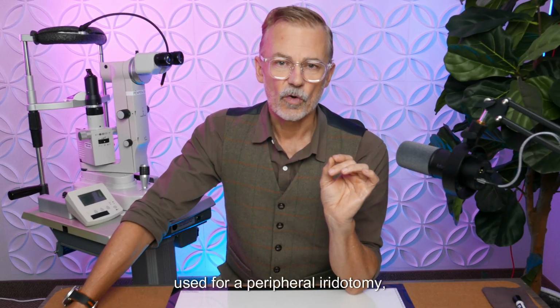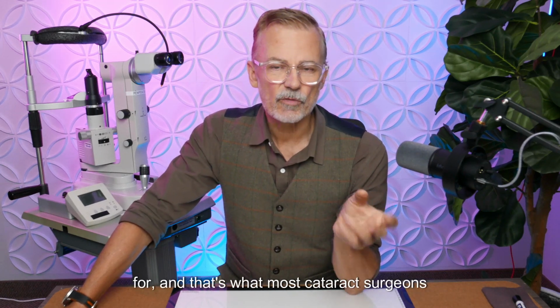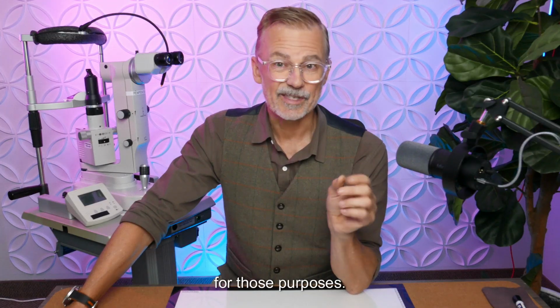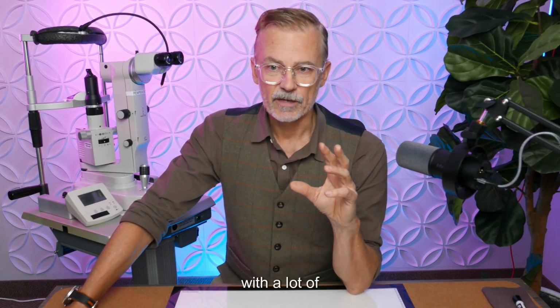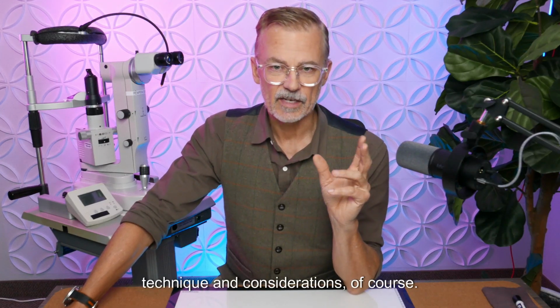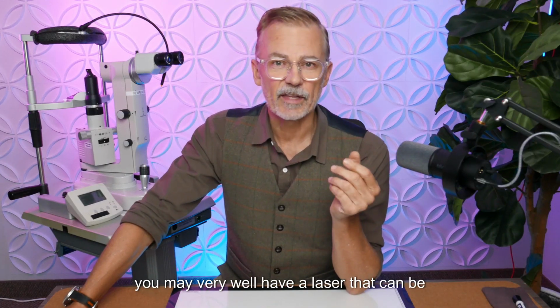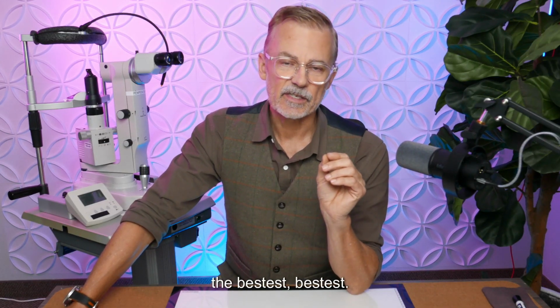Occasionally used for a peripheral iridotomy, for emergent eye pressure control, but that's what the laser's usually used for, and that's what most cataract surgeons and most ophthalmologists will have access to the YAG laser for those purposes. I'm adapting it for a different purpose with a lot of modifications of technique and considerations, of course, but you may very well have a laser that can be used to treat eye floaters. So the latest, greatest is not necessarily the best.